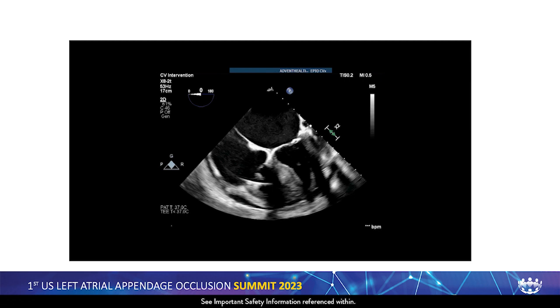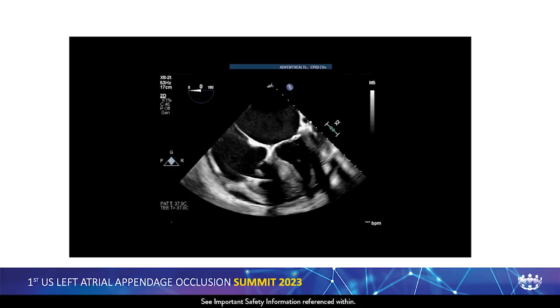So here's the question: what could we do in this case? We decided we need to understand this a little bit better and put ICE in the left atrium and understand if this goes away or not. Another way to do this was to use isoprel in such cases as well, where some of this goes away. But we get much more confidence in Amulet in cases like this because your implant is much more proximal. So you're not disrupting some of the stuff, and you can close some of this. So this patient really needed it, so we went with it.